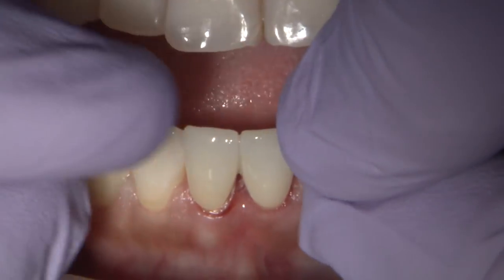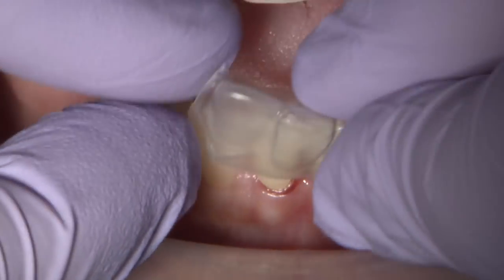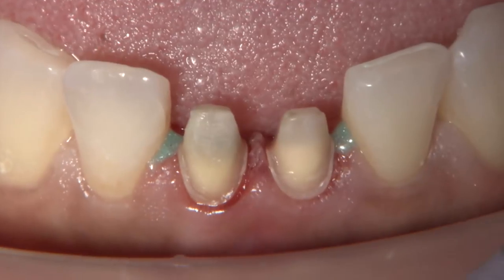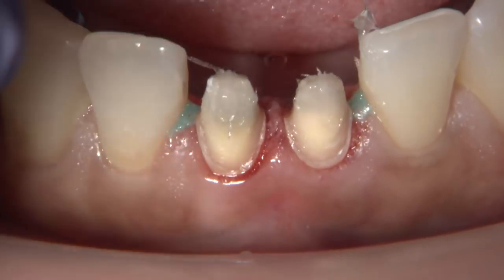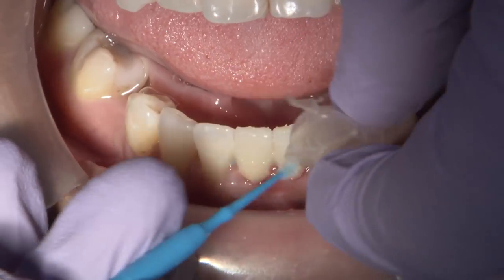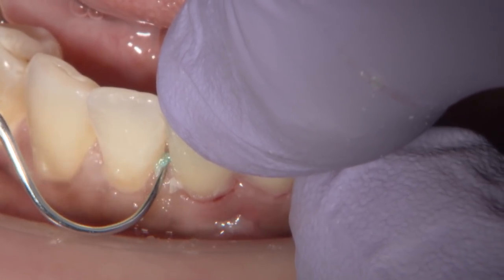Here is another interesting BioTemp placement, and one that I don't see very often. This patient had teeth numbers 24 and 25 endodontically treated, necessitating crowns to restore them. In cramped areas such as the mandibular anterior, the Fast Stent comes in handy to hold the very small and very thin BioTemp shells in place. Most lower anterior preparations need a small amount of blockout, and I will apply this along with a smear layer of Vaseline and light cure before final reline is administered. The stent is removed easily enough that pressure from a bendable microbrush does the trick. The ultra-thin flash trained by the stent can be removed to expose the blockout resin, which is just as easily discarded.